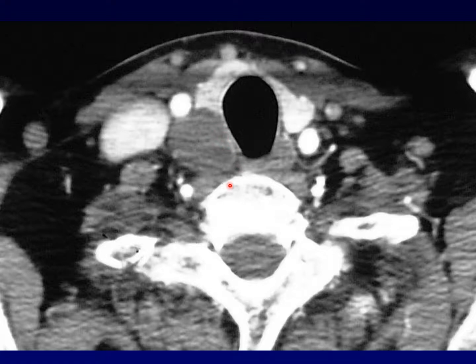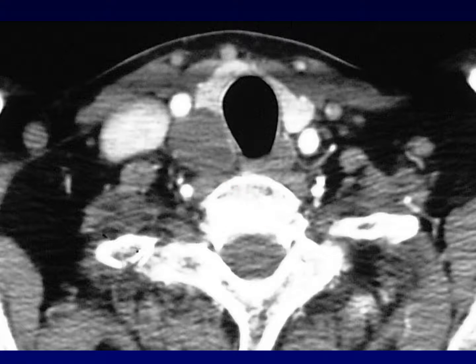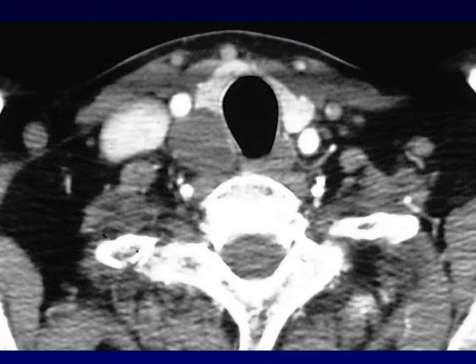This is another simple parathyroid cyst. It does arise from the parathyroid gland, not the thyroid.